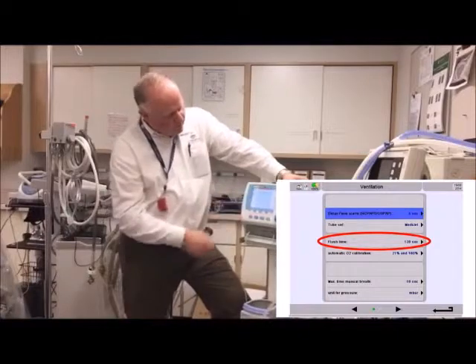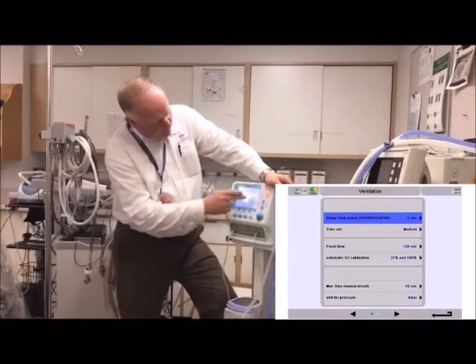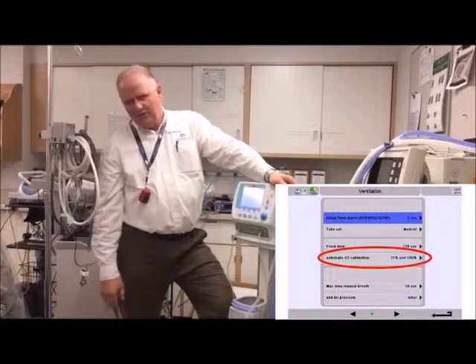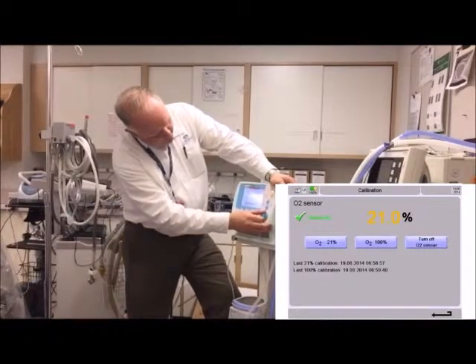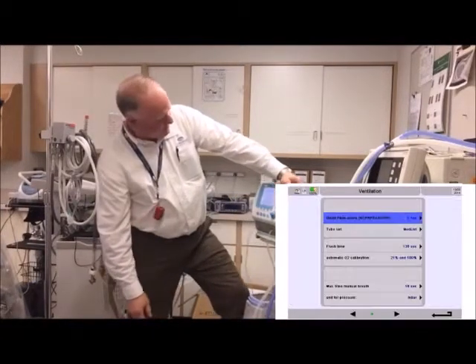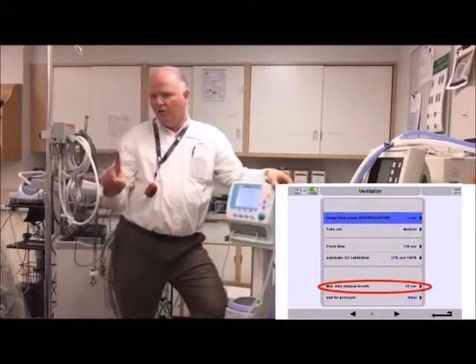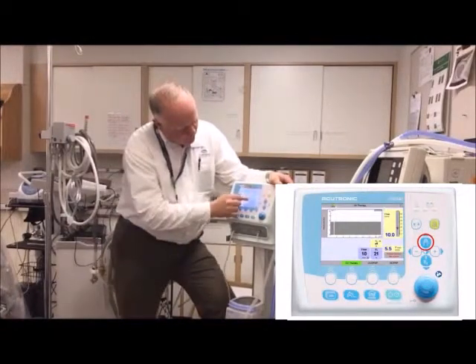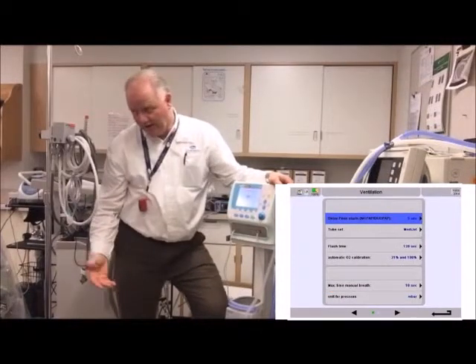For oxygen calibration, it's set up for two-point cals, which is probably the better way to go — I'd leave it there. Down here is the maximum time for the manual breath. Right now it can be held for a maximum of three seconds before it drops the pressure back down, but you can go up to 30 seconds. Let's set it to 10 seconds.